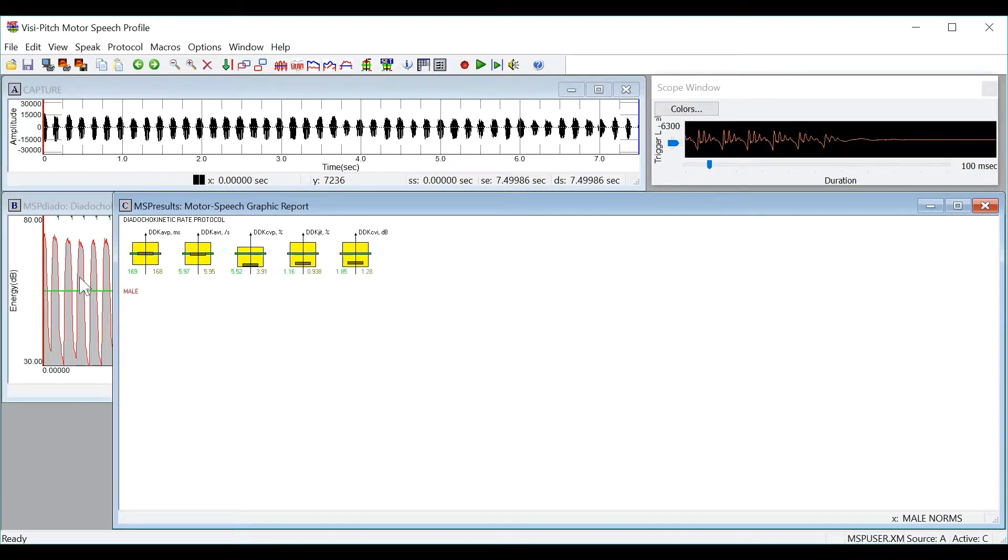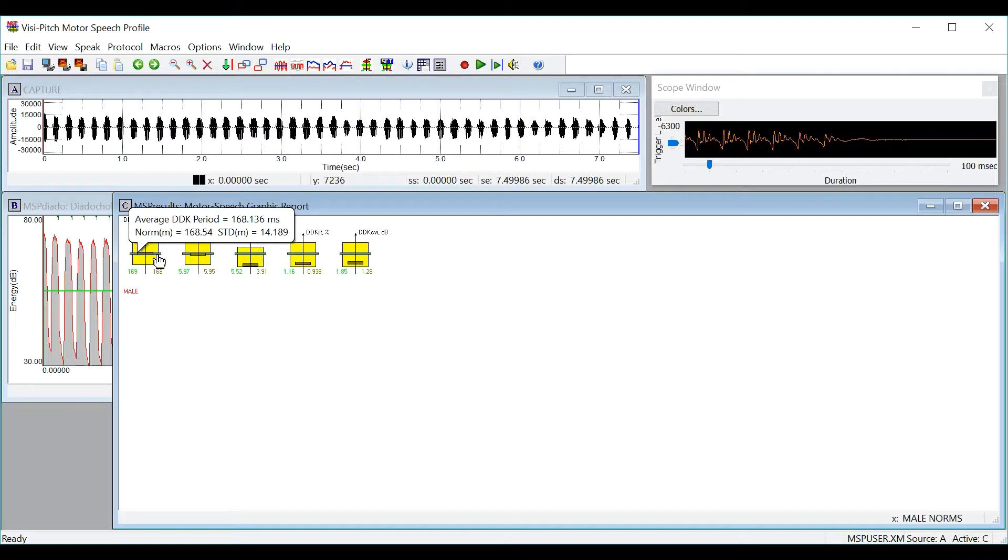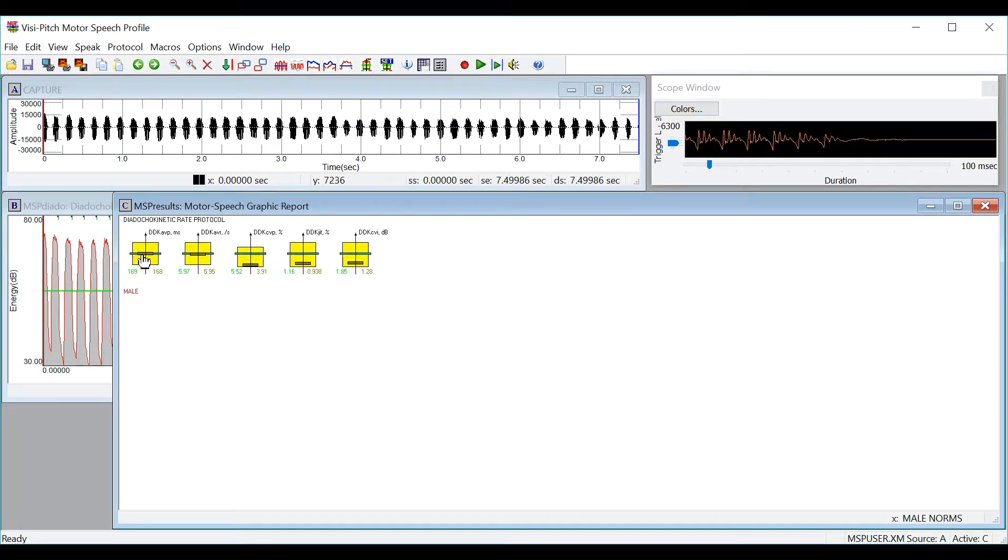And here in green you will see the values for the normative data and in dark green you will see the values for the recording and in yellow you will see the standard deviation.